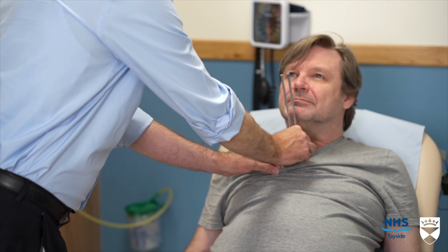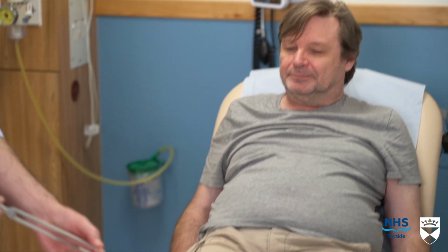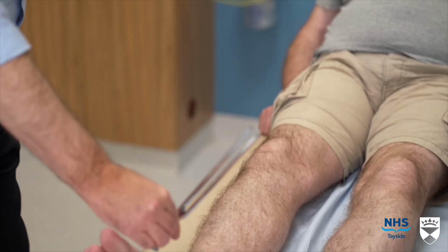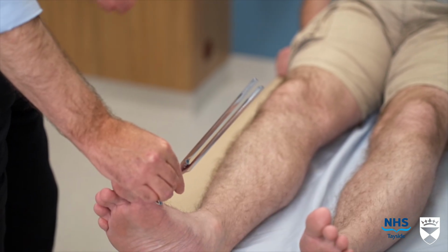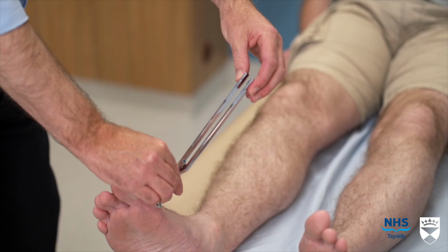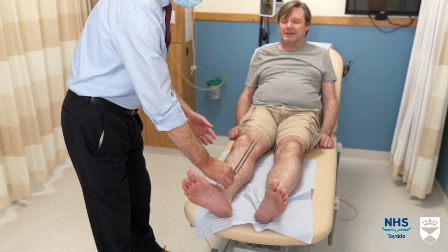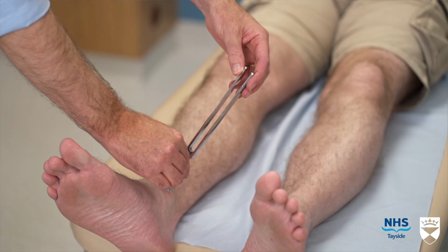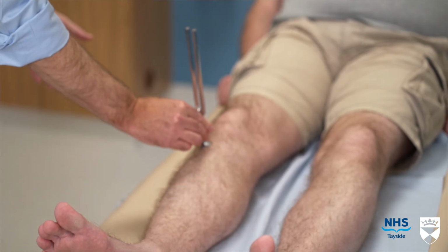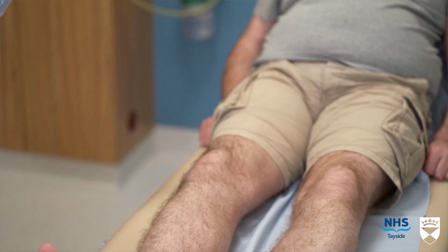Before testing lower limb vibration sensation, test vibration sensation on the sternum. To test the lower limbs, place a vibrating 128 Hz tuning fork on bony prominences, starting distally on the interphalangeal joint of the big toe. If sensation is impaired, move proximally to the malleolus, knee, and anterior superior iliac spine.